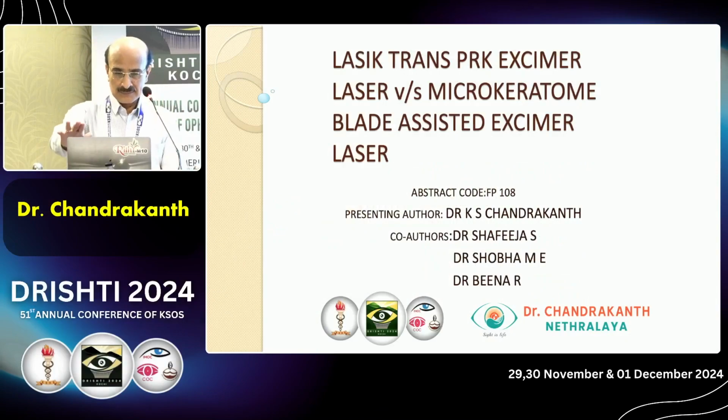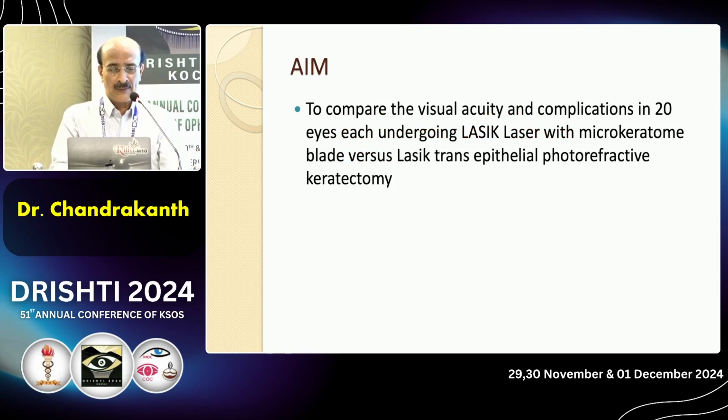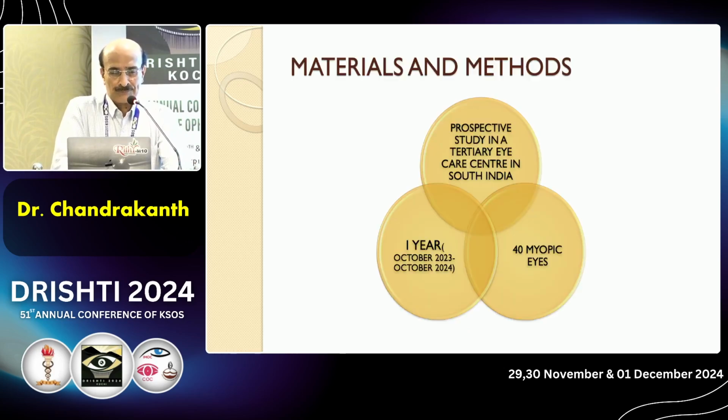My paper for the day is Lasik versus trans-PRK. The Lasik laser is using a microkeratome, and the other one is trans-PRK. The aim is to compare the visual acuity and complications in 20 eyes which are undergoing Lasik laser with a microkeratome blade versus Lasik trans-epithelial photorefractive keratectomy.